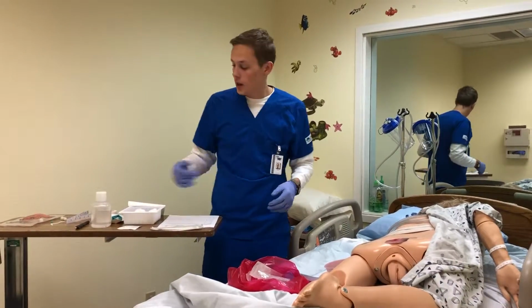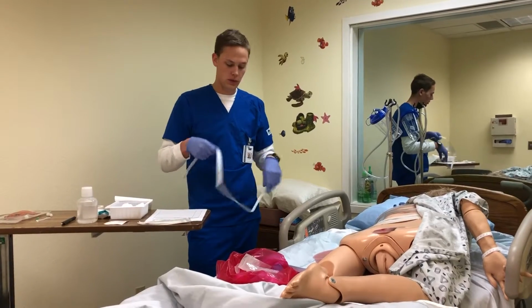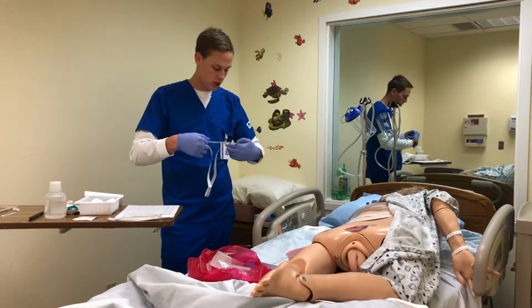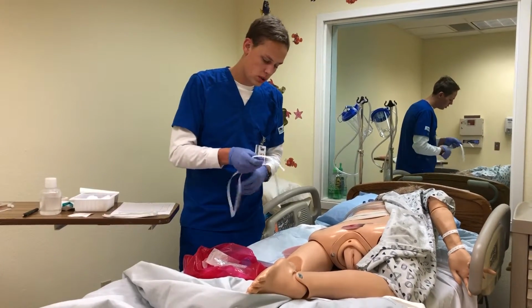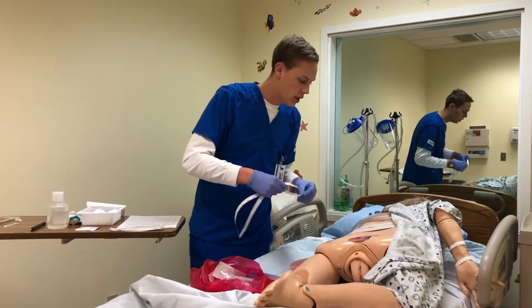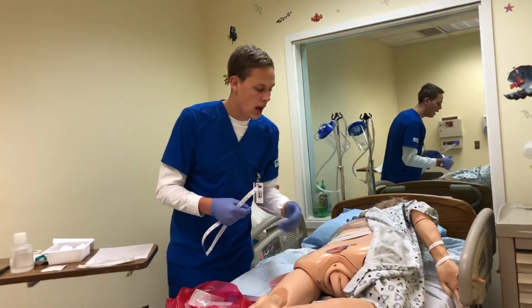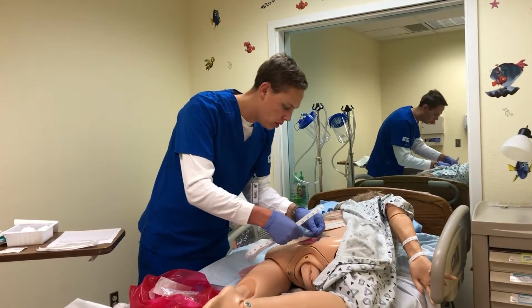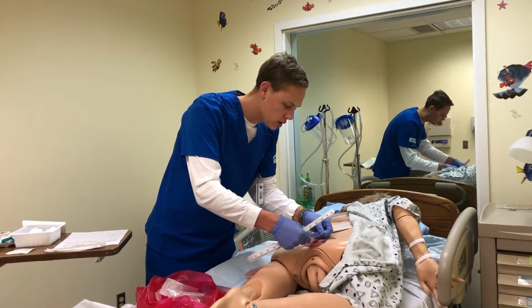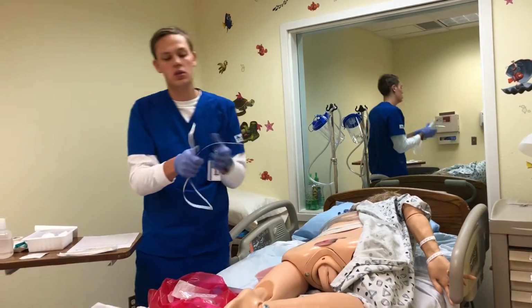So now that that's done, I can measure the patient's wound. So let's see here, we're going to measure it usually in millimeters or centimeters. So we're going to measure the width, the length, and so this one's going to be roughly 7 centimeters by 6 centimeters.